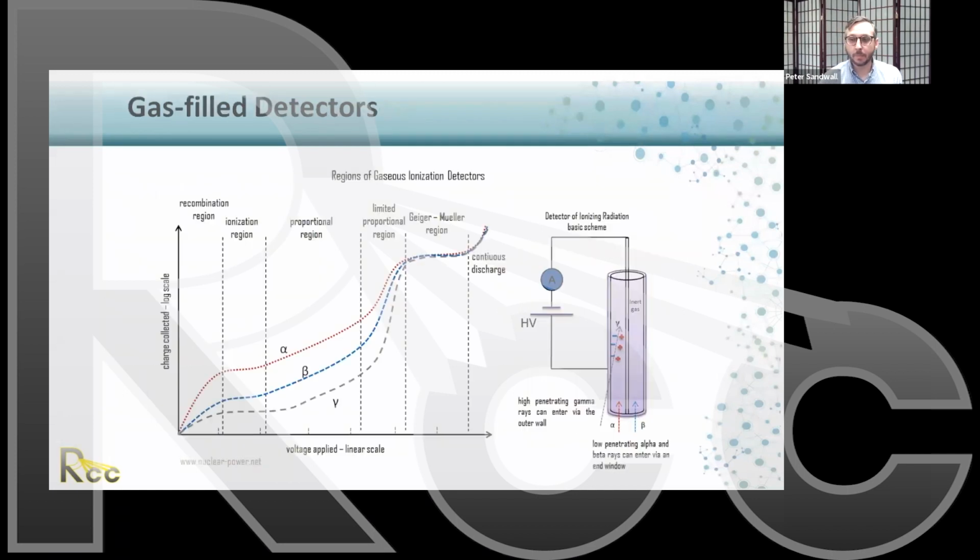And we'll come back to this. Let's just get started with the detectors now. So gas filled detectors. They're a class of detectors, a family. As physicists, we're typically responsible for knowing this curve, the gas amplification curve. Too low a voltage on a gas filled detector, and you've got recombination, so you can't get a good measurement. Too high a voltage, you've got continuous discharge, kind of saturation, where the thing turns on and it won't turn off.